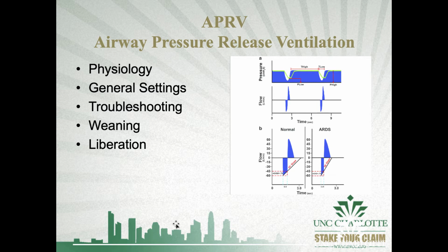So if we increase or decrease our time high, what do you think happens? Well, we increase the amount of releases. So that can be like increasing your respiratory rate. We'll get into that a little bit later. But those are your general settings.